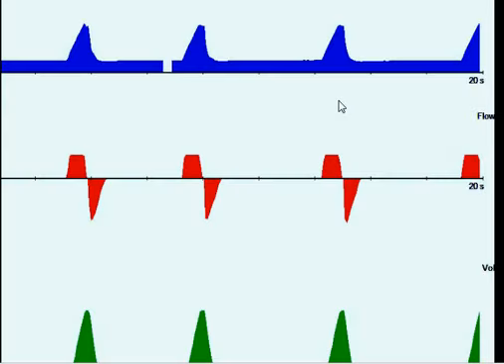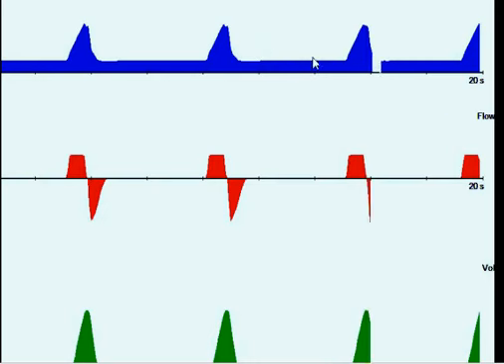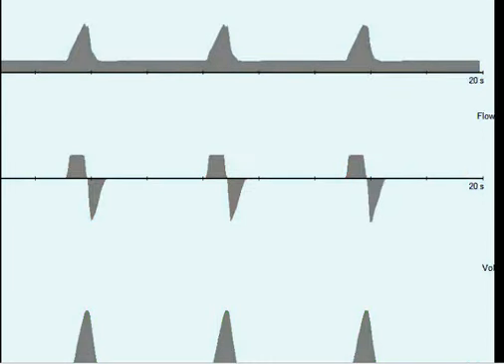This video clip shows the PMAX mode in action. What the PMAX mode is, it's a dual controlled mode in Draeger ventilators, which starts out as a volume controlled breath. So as you notice, I have a constant square waveform and a variable pressure waveform, which is in blue. I have a tidal volume of approximately 500 cc's, and it's creating a peak pressure of 22. So here's my baseline in gray. It's grayed out to show the contrast.